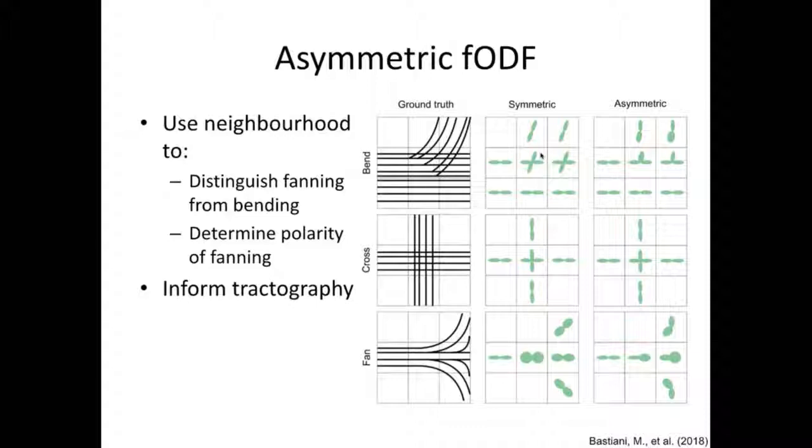So in gray matter, that's a good question. There are more advanced models that are capable of analyzing data coming from gray matter. Just because in gray matter you have, like I said before, water more freely diffusing, but it's true, you do have a certain degree of anisotropy given by the fibers that enter the cortex. So yeah, you need more advanced modeling for that, but it's certainly possible.